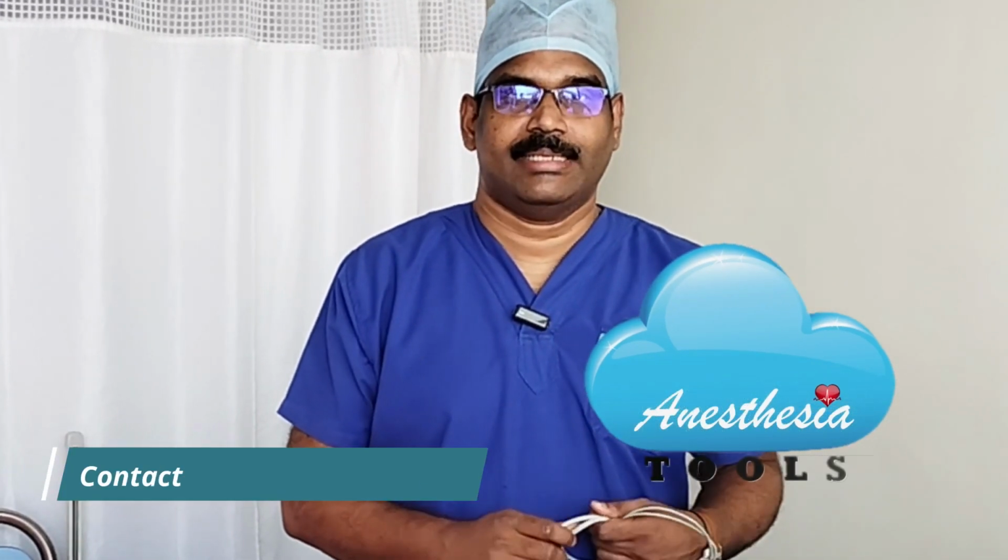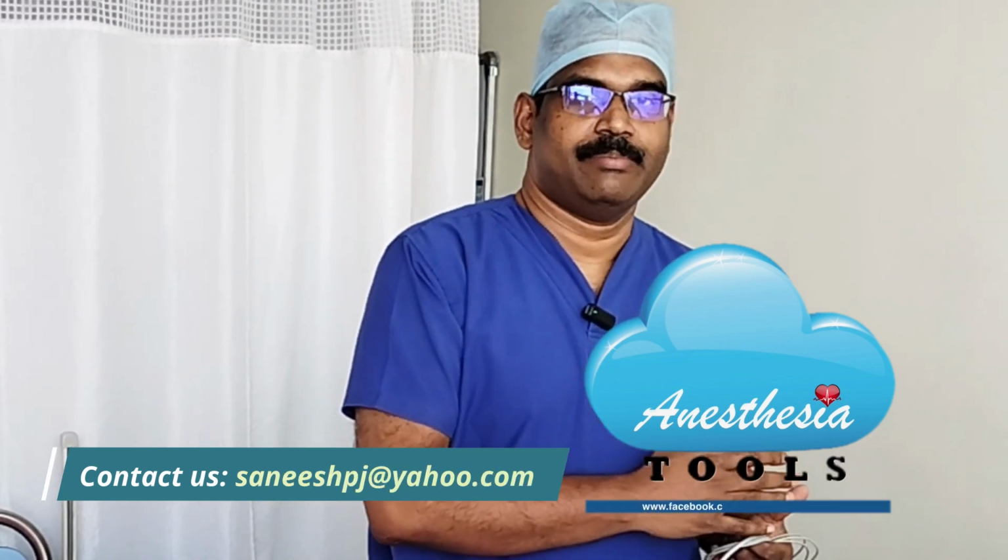So next time when you happen to use this machine, manual external defibrillator, try to understand the machine, use it more sensibly.